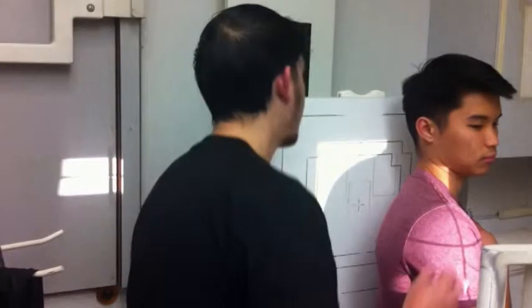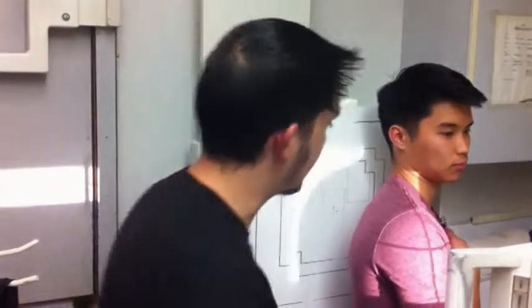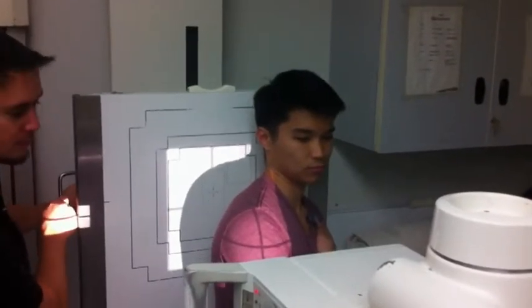And in order to get the CR, the CR enters his right shoulder, AC joint, 1 inch inferior to it. So then my tube raises up just a little bit.